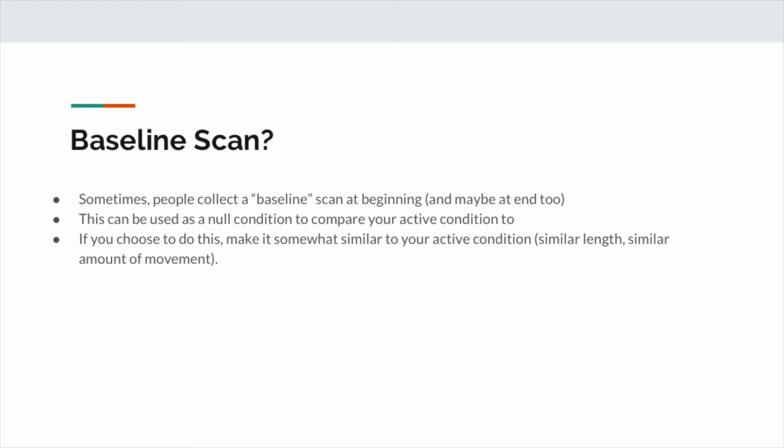This isn't necessarily required if you have other ways of generating an experimental null. For instance, you could bootstrap a null distribution between people watching different videos, but baselines can be a quick and easy way to get your null distribution experimentally.